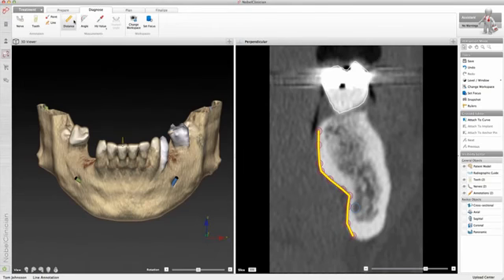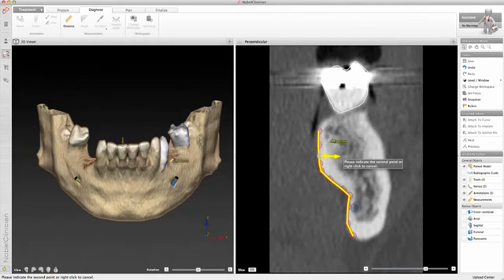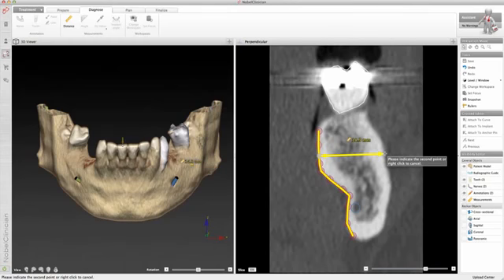The distance tool measures distances in 3D. Just indicate two points. The measurement can be updated by moving the points.